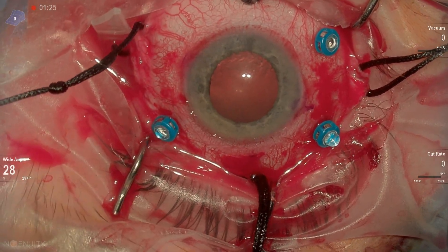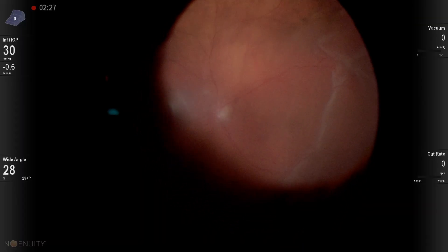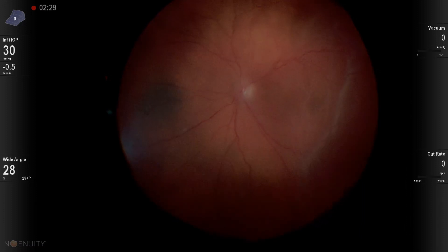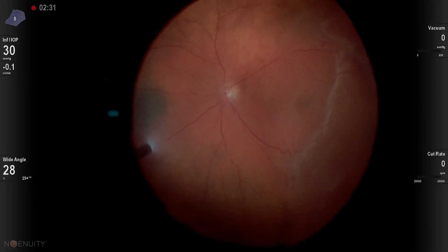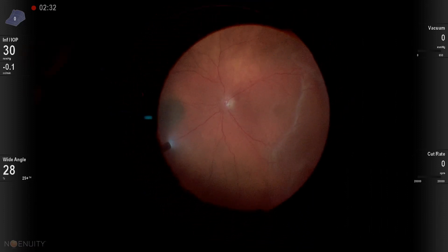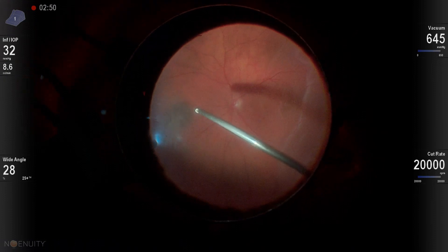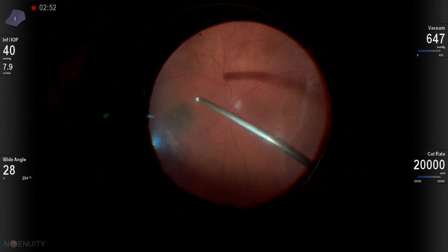This is a pars plana vitrectomy for a retinal detachment, fairly sizable tear about a clock hour to a clock hour and a half located supertemporal in this patient's eye.